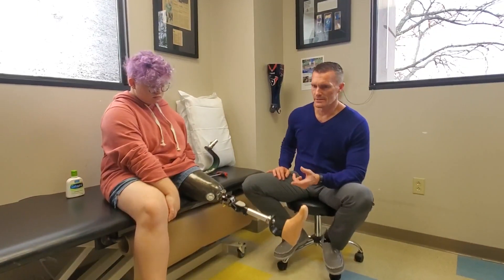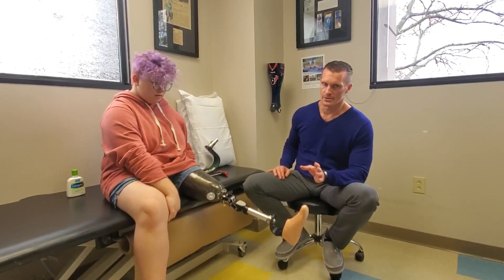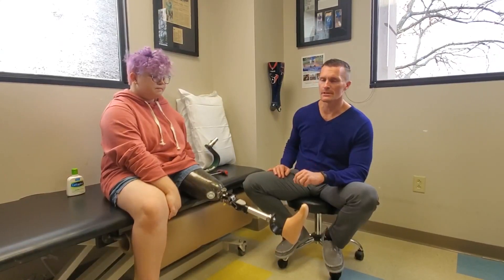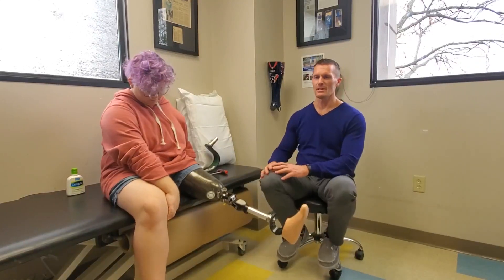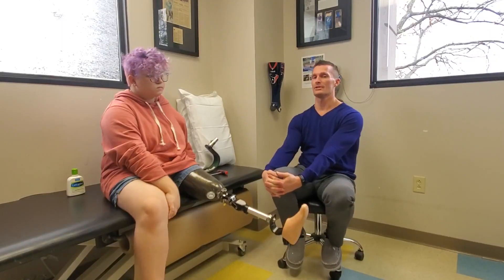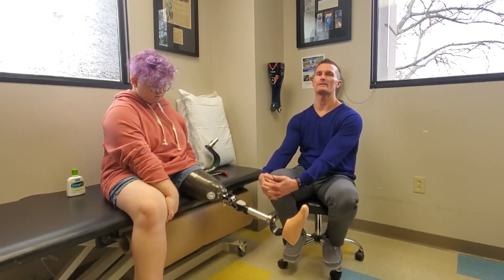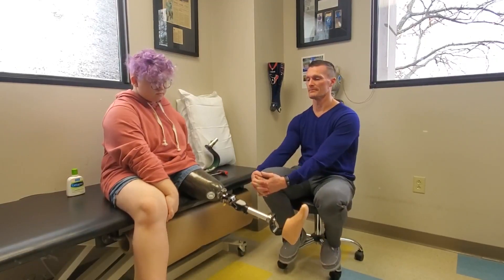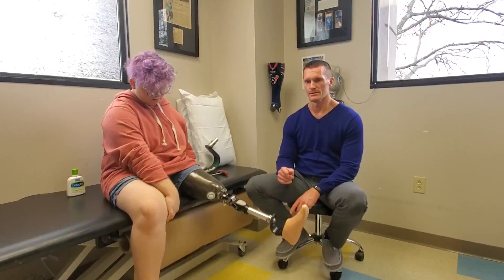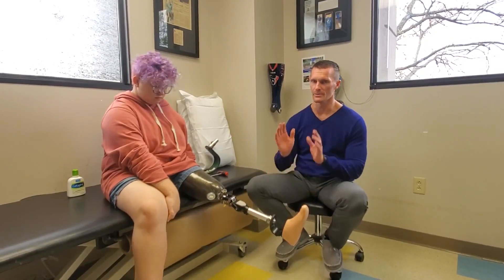So Brooklyn had tibial hemimelia, had a knee disarticulation, and had a lanyard suspension with a gel liner when we started eight years ago. So I'm going to say this might be our third socket — we haven't been on a ton. This is the third time we've probably re-casted everything. A common dilemma we run into: when Brooklyn was much younger she was shorter and a different weight for components, but she still tore everything up. We just didn't want to put a heavy knee on.